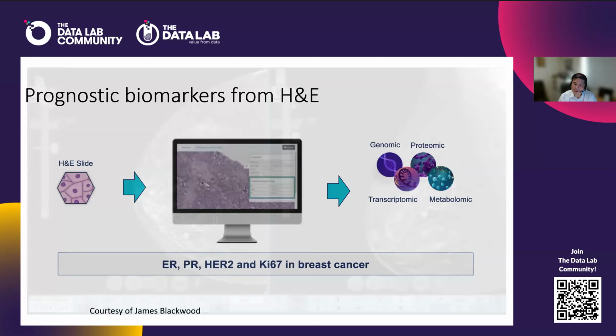AI is moving to other areas of the breast world, including into pathology. Pathology at the moment is slides on a microscope, but a lot of centers are starting to move towards digital pathology. So their slides are scanned onto the same sort of picture systems that we use in X-ray. By doing that, you are helping the pathologist because it does automatic counting and automatic classification. There are benefits hopefully for prediction and prognostication in future with use of AI in pathology as well.